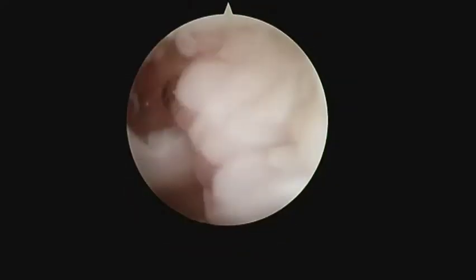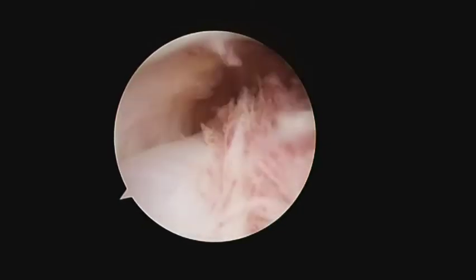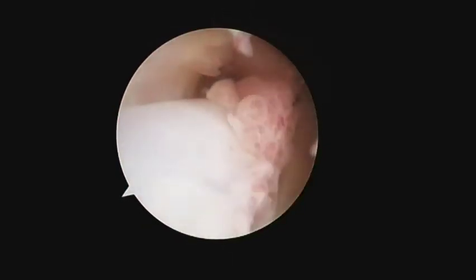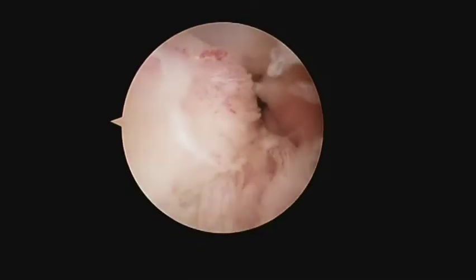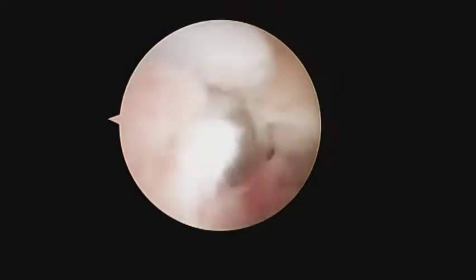First of all, zone 2 peroneal longus tendoscopy is performed with the proximal portal as the viewing portal. Complete synovectomy is performed from the cuboid tunnel region to the proximal fibrous orifice of the zone 2 peroneal longus tendon sheath.